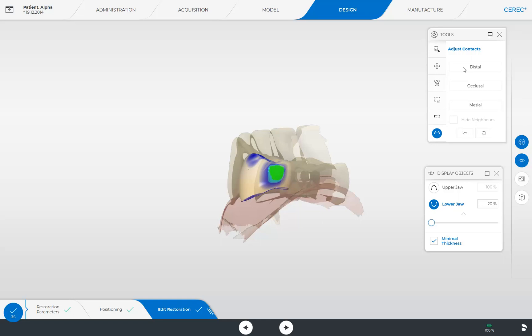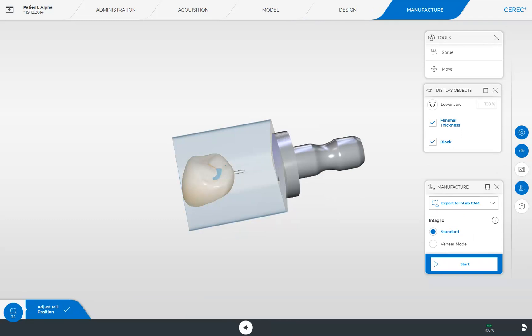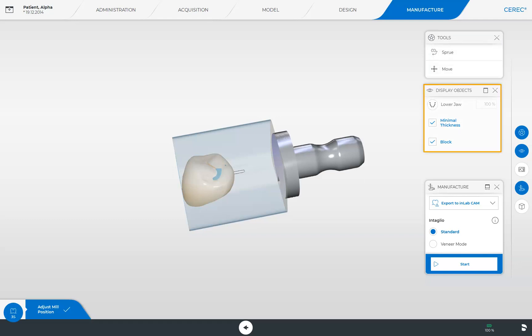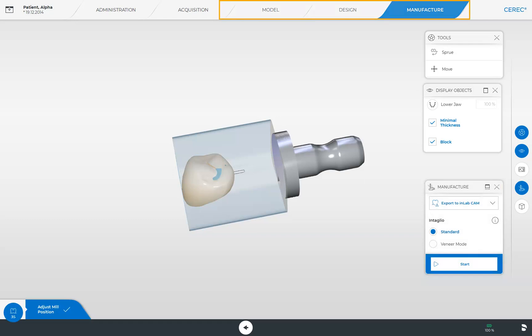Finally, we go to the last phase, the Manufacture phase. This phase also offers tools for correcting the sprue location or moving the restoration in the block. You can also display the lower jaw again or blank out the block. In the Manufacture window, we can determine whether the restoration will be manufactured by a connected grinding and milling unit, or whether it should be exported into the InLabCAM software. During the model, design, and manufacture phases, it is also possible to send the case data to a partner lab via our CEREC case center portal.